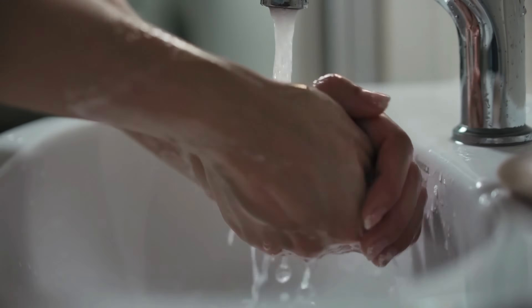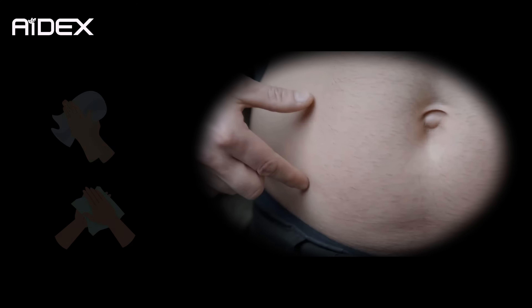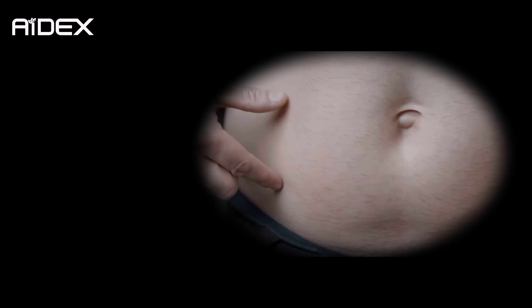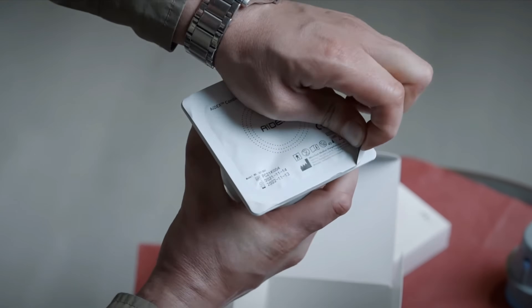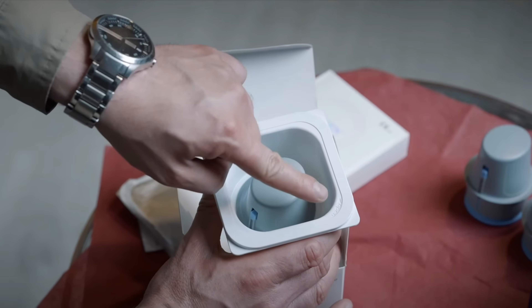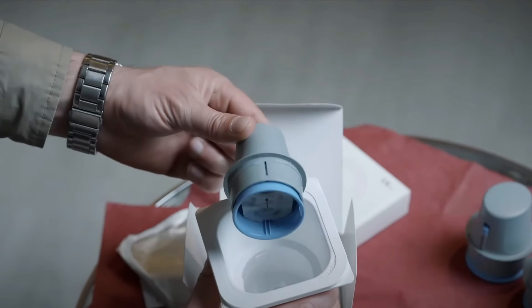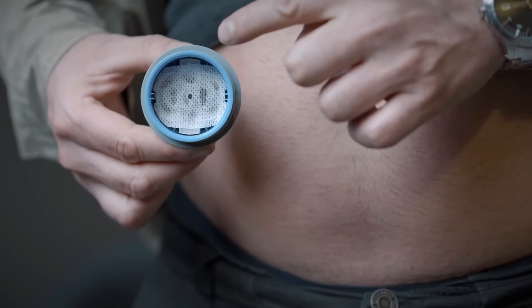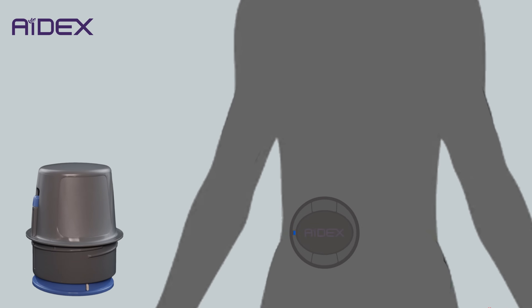Thoroughly wash your hands with soap and water. Clean the application area with alcohol and allow it to dry for a minute without using a towel or tissue. Remove the sterilization cap starting from the black arrow. Rotate the applicator counterclockwise to take it out. As you can see, the sensor is pre-inserted inside the applicator.